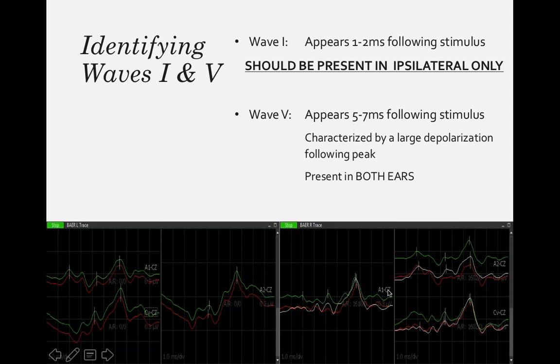What's important is that you have your montages properly labeled and you understand what these montages stand for. Obviously, A1, because it's an odd number, it's going to be a left-sided electrode. A2, which is an even number, that's going to be our right-sided electrode, and that convention holds for all of our 10-20 markers, which we should all be very familiar with by now.